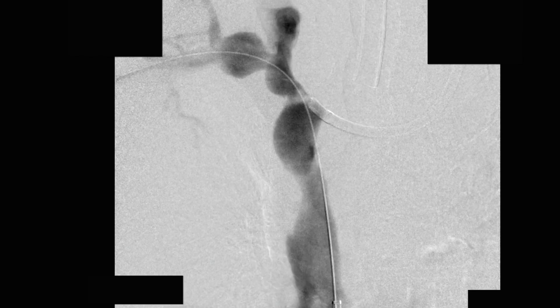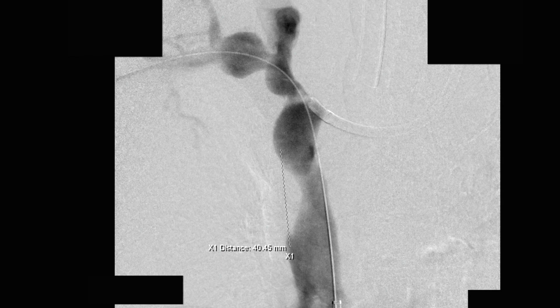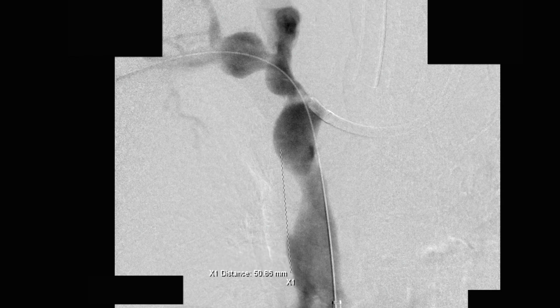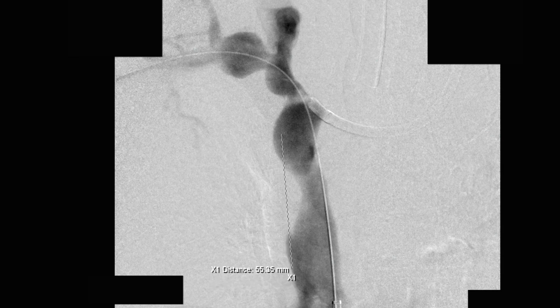A repeat venogram showed that there had been some improvement in the stenosis in the superior vena cava, as well as the right brachiocephalic and right subclavian veins, but there was persistent stenosis. So we opted to stent the superior vena cava portion.